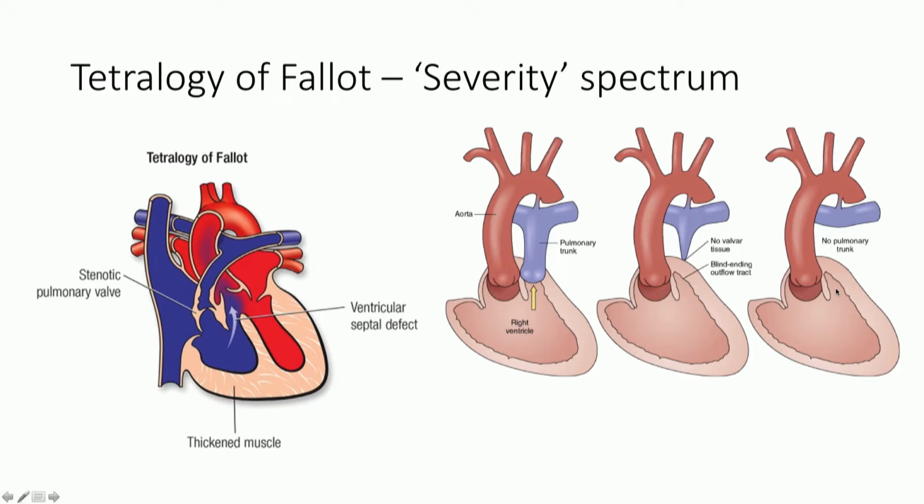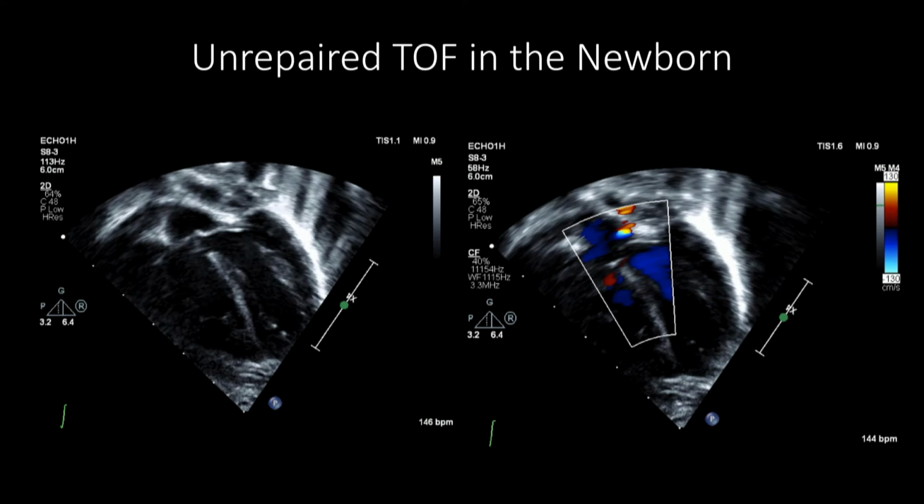So in these patients, the repair is a little different. It's more than a patch or muscle bundles removal. These patients frequently require a conduit, an RV to PA conduit, right? And they may have had the conduit when they were kids, so it's important to look for conduit stenosis as they grow. They may have to have that conduit upgraded to a larger size.